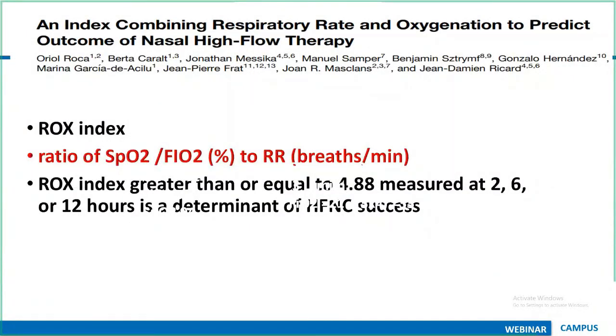So I told them I want to know the details. Those people don't even know how much FiO2 they are keeping. When I asked, the FiO2 was almost 90%, and he was saturating at 92. Then I asked for an ABG. The ABG was showing a CO2 value of 18 and a pH of 7.6. What does it mean? The patient has already gone into respiratory alkalosis. Why? He is severely tachypneic. You can see that from the ABG itself.